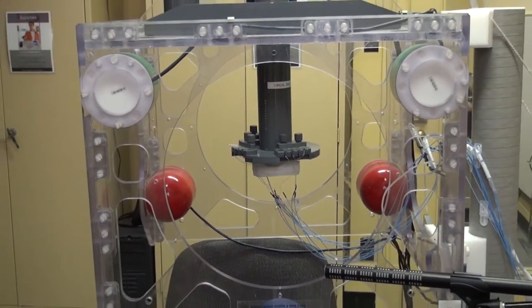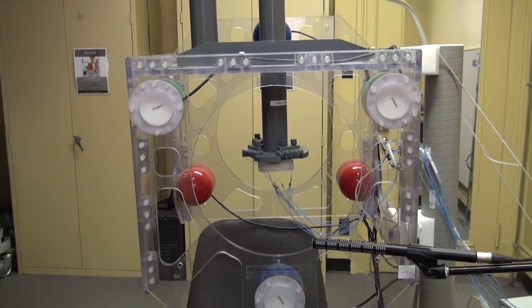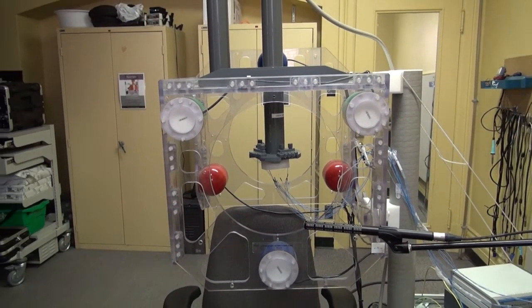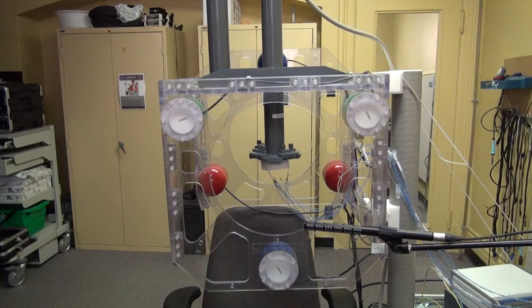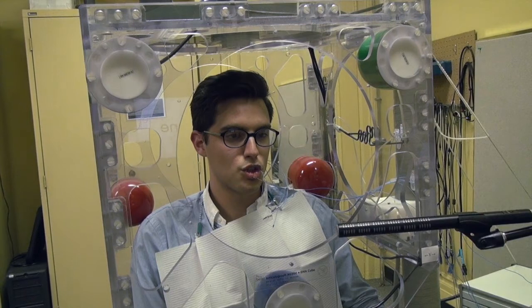The Electromagnetic Articulograph, or EMMA, is a minimally invasive magnetic imaging device that uses electromagnetic fields to track the movements of speech articulators over time during speech production tasks.